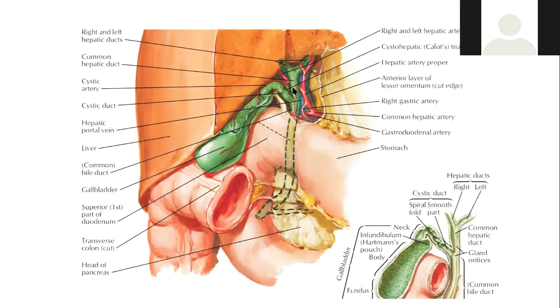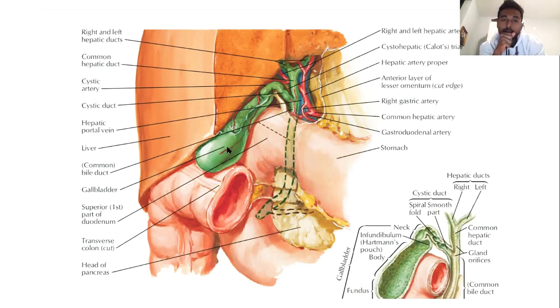I can see it if you put the transducer at a certain angle and position, but if I was just in a straight sagittal view, it wouldn't make sense to me. So like I said, it's trying to get a profile view of the gallbladder, right? Because I know a straight sagittal is like this, but for a gallbladder, if I did that, it would be a transverse cut of the gallbladder.